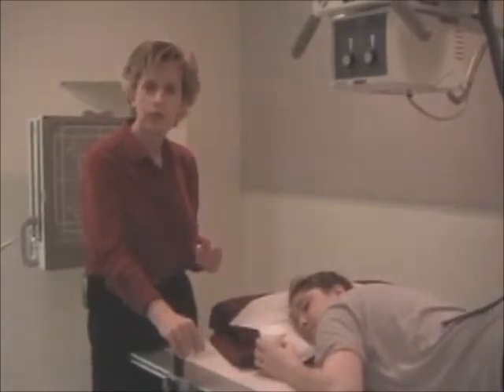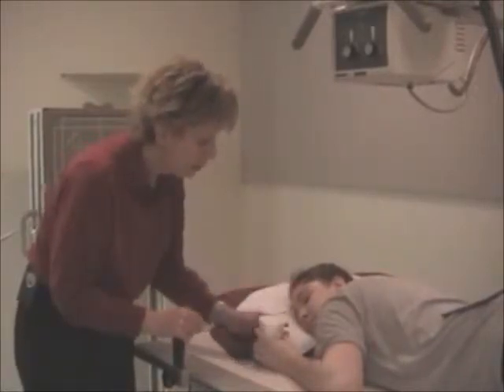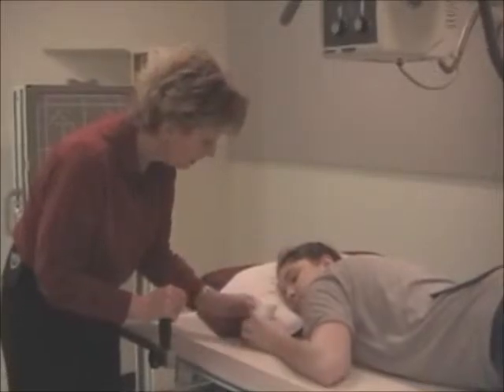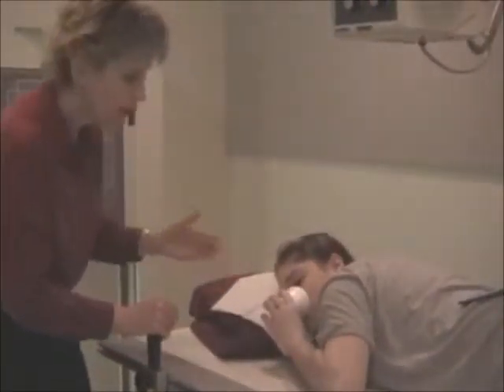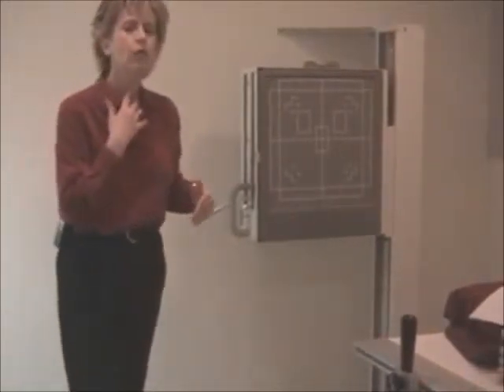Again, your option would be to do it in a vertical mode. Again, we talked about cooperation with the patient, and they have a cup of barium. There's a straw, and again, you've explained to the patient what your job is, and I'm going to have you taking a big mouthful and watch them. She actually has a straw, and then you'd go to your exposure panel and okay, taking another big mouthful, swallow it, and you're trying to watch the epiglottis, and I recommend on about the 4th swallow, you watch the epiglottis, and when it moved up, the esophagus opened up and the barium went down. So you try to press the expose button at the time that you see the epiglottis go into a vertical motion. And hopefully we catch the barium in the esophagus.